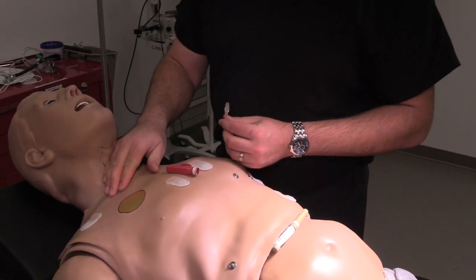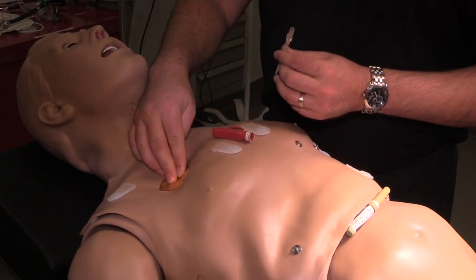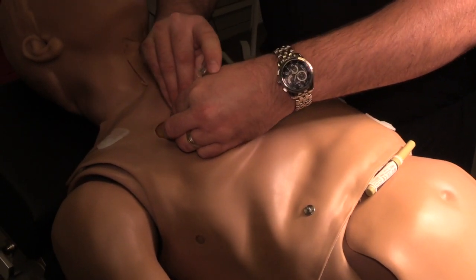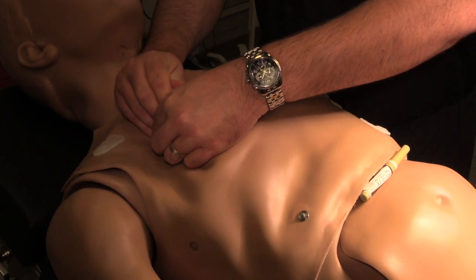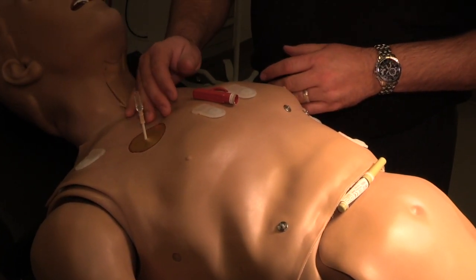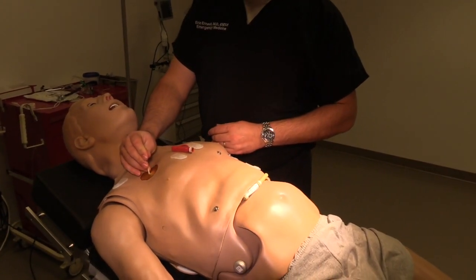So when we find that spot, we'll find the sternum, walk over, find the second and third rib, the second intercostal space, puncture the chest, and go down. I'll go until I hit a rib, then walk the needle over and push it down in. There are a couple of different teachings on this. Once you make entry, go ahead and start pulling the needle out. Some of the newer literature, especially with the TCCC training program, says you leave this catheter on the needle itself until the needle is all the way into the chest.